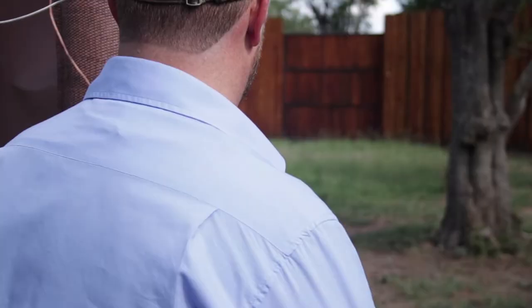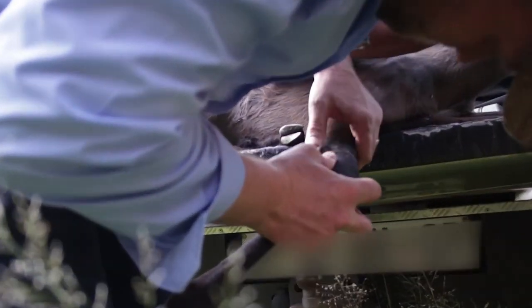What are you expecting? The biggest thing is we obviously know it's got a fractured leg. The client sent us some photos and a video, so we know the leg's fractured. Just where and how bad the break is, is something we've got to look at. The first thing we'll have to do is dart it so we can assess how bad the break is. We know it's the front right leg - is it above the elbow, is it in the joint, is there more than one fracture? We'll do an anesthetic and then assess it.